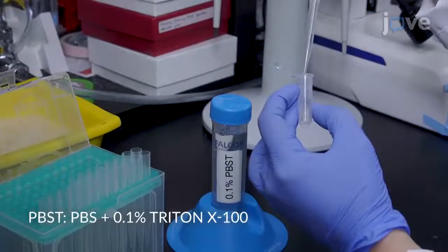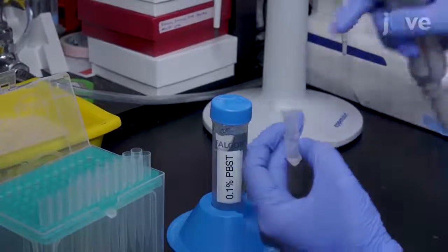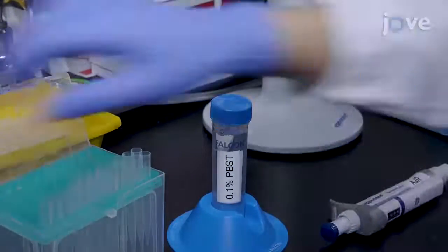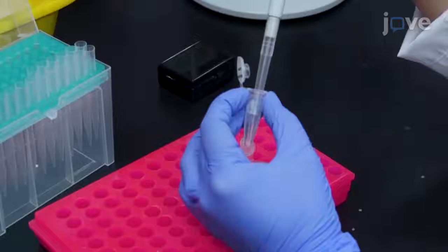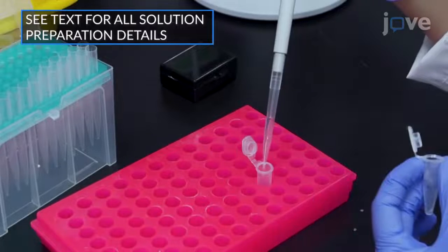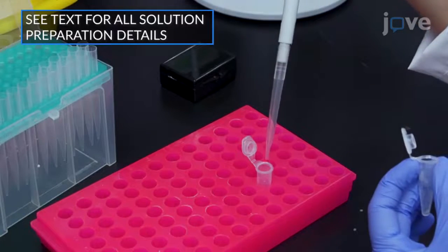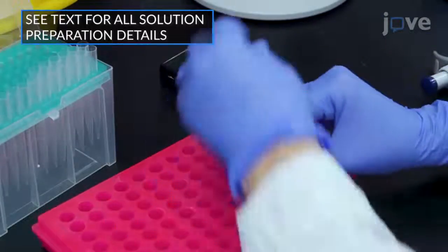To permeabilize the embryos, replace the PBS with PBST and place the embryos at 4 degrees Celsius with gentle agitation overnight. The next day, replace the PBST with 600 microliters of blocking buffer without touching the embryos for a 16 to 18-hour incubation at 4 degrees Celsius with gentle agitation.